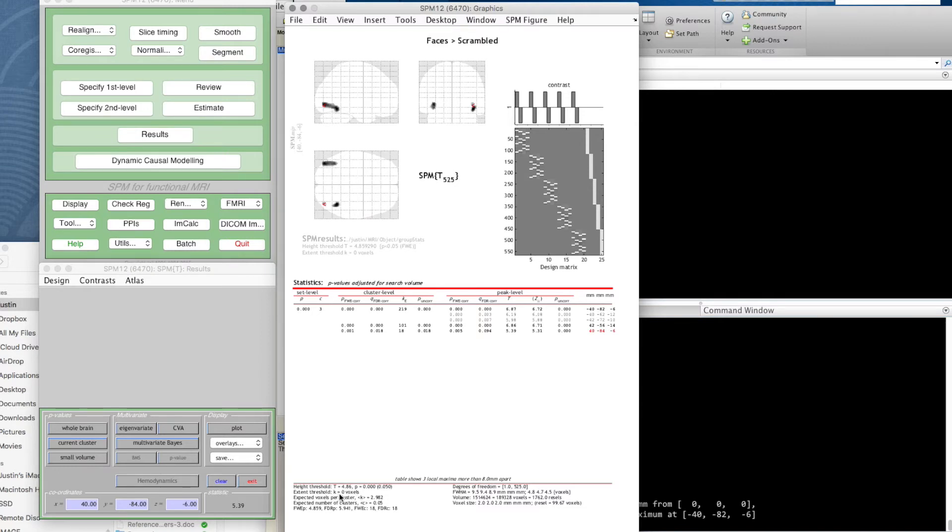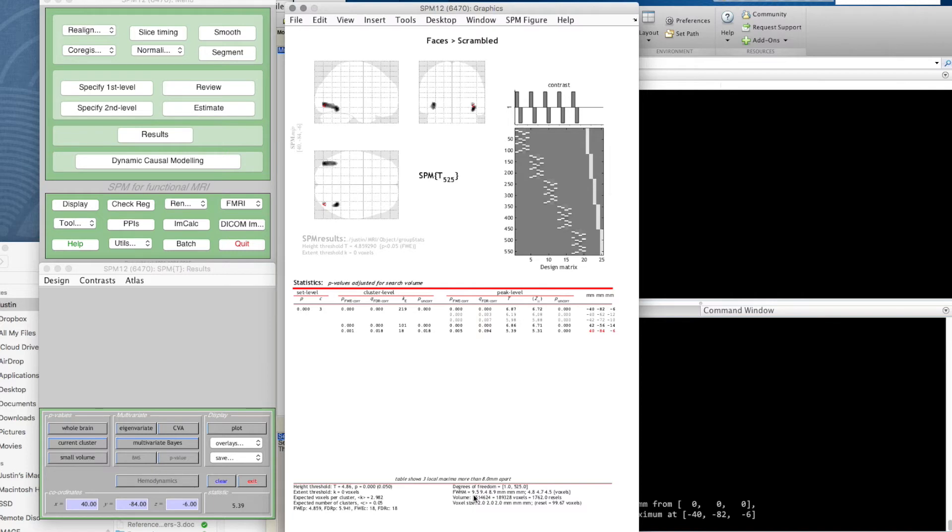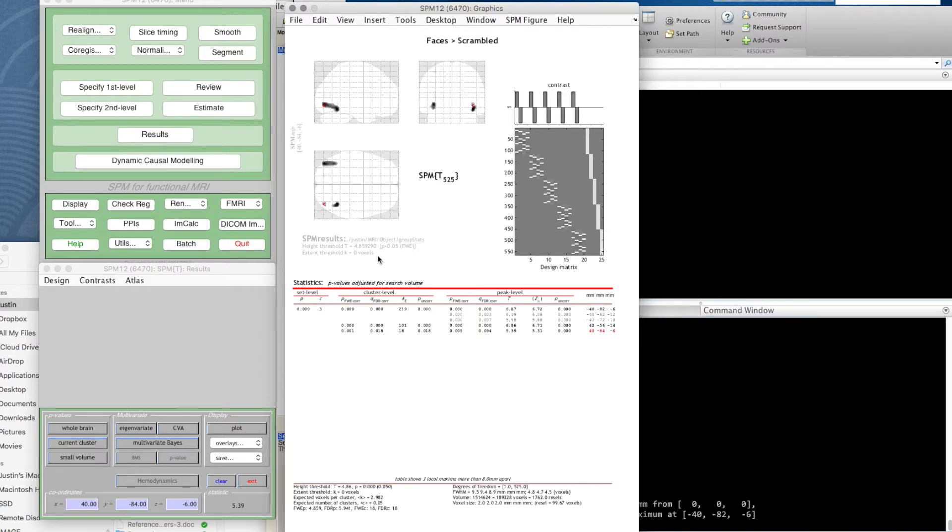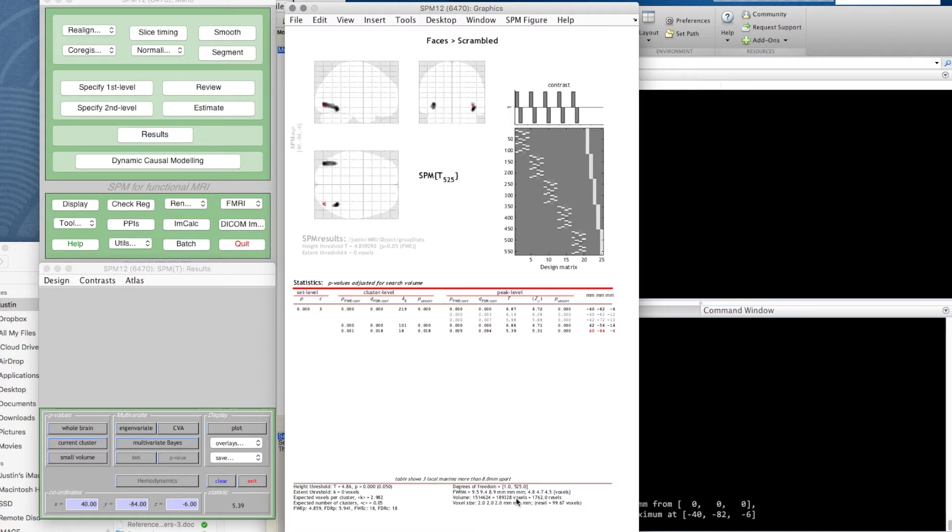It's showing the expected voxels per cluster, expected number of clusters. This is giving us a measure of the smoothness of the data—not how much we smoothed it by, but it needs to calculate the smoothness of the data to figure out the correct threshold for the statistics. The volume is 189,000 voxels. Remember, these are two millimeter square voxels, not the original three millimeter we started with. Because of the smoothness of the data, that's 1,762 resels or resolution elements.